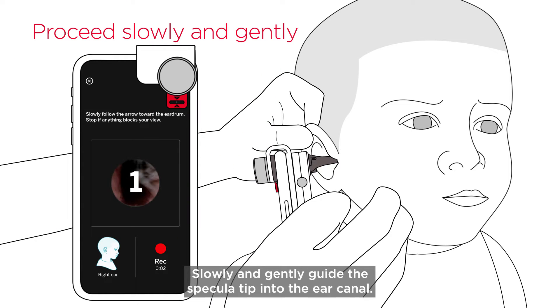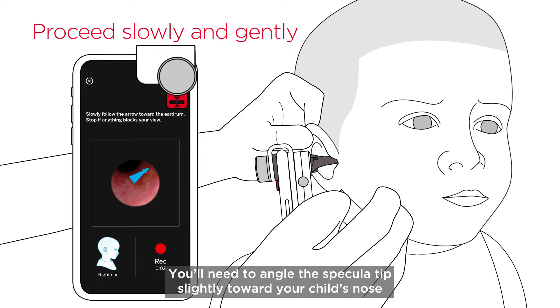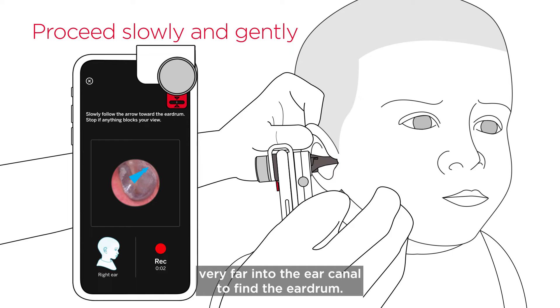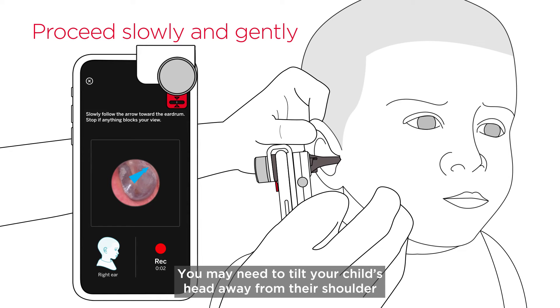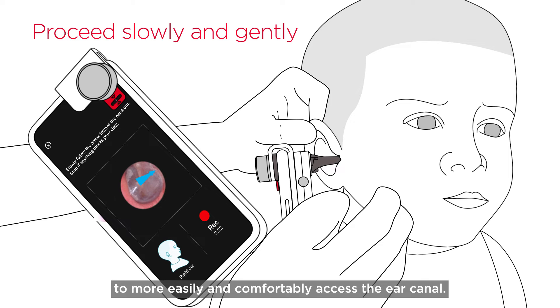Slowly and gently guide the specula tip into the ear canal. It should look like you're moving down a small tunnel. You'll need to angle the specula tip slightly toward your child's nose to follow the natural curve of the ear canal. Keep in mind that you should not have to insert the specula tip very far into the ear canal to find the eardrum. The eardrum finder arrow will help guide you by pointing in the direction you should move the specula tip. You may need to tilt your child's head away from their shoulder or rotate your phone slightly to more easily and comfortably access the ear canal.